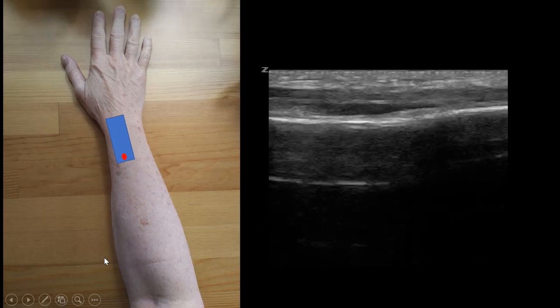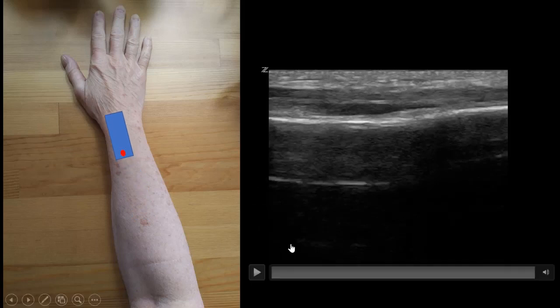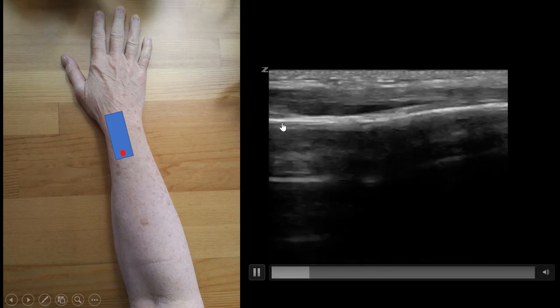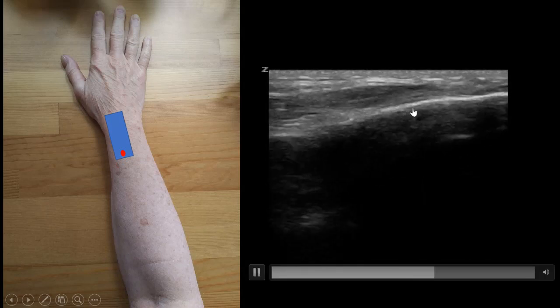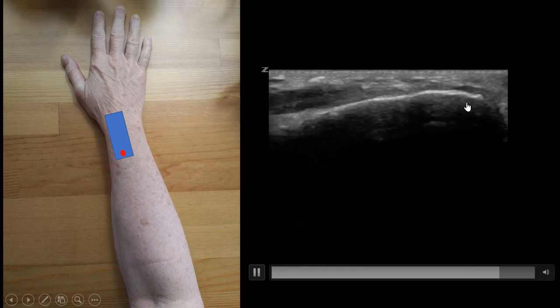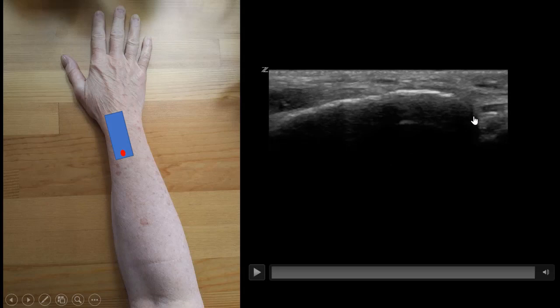Next, we're going to slide the probe towards the patient's wrist. When we do that, follow this white line until you get to the area representing our wrist joint.